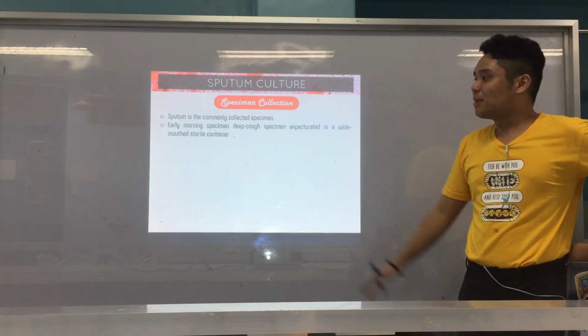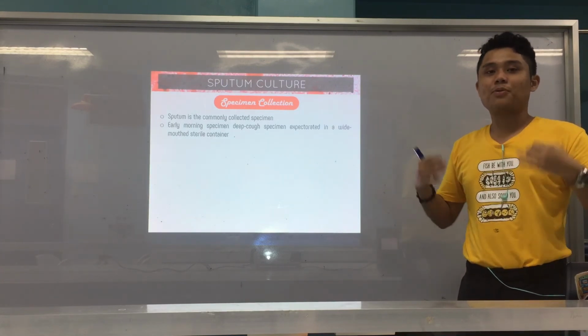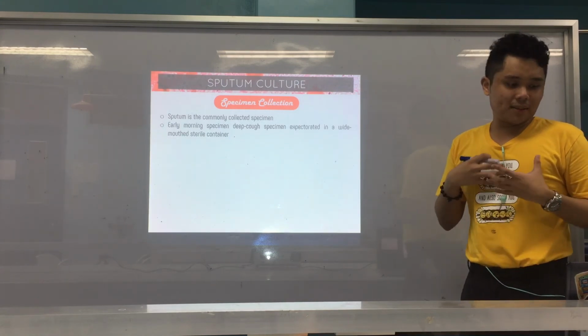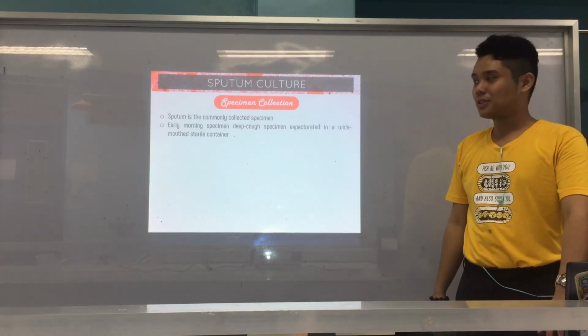But yes, early morning deep cough. Usually we instruct the patient to take deep breaths twice, and on the third deep breath, cough it out, so that the sample comes from deep in the lower respiratory tract. Early morning, wide mouth, sterile container, as sterile as possible.